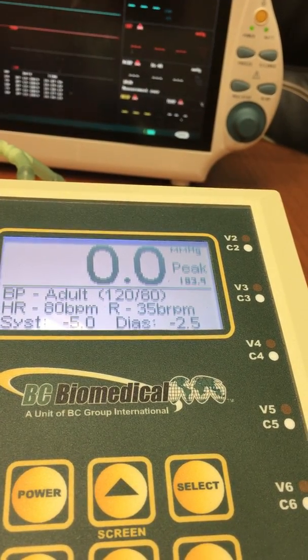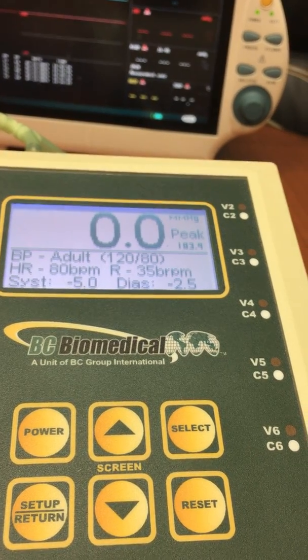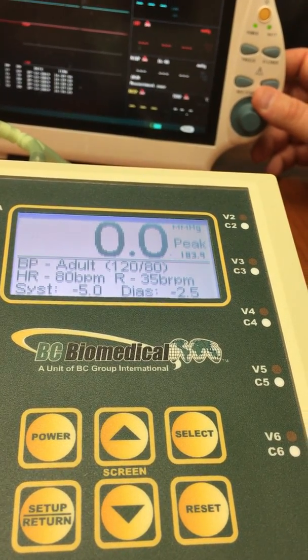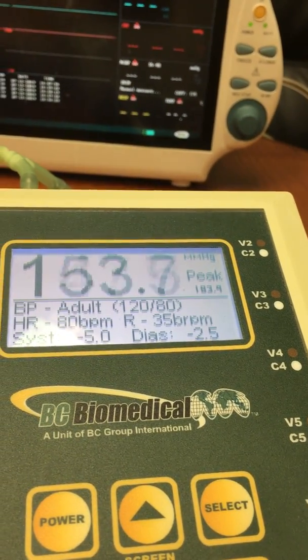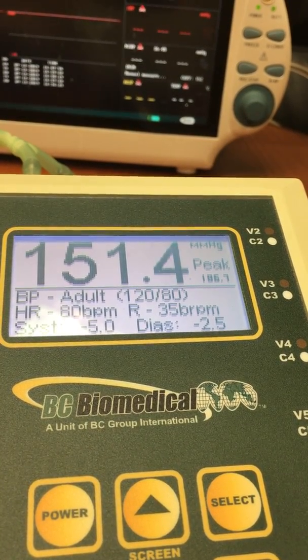For MindRays, we know that the offset needs to be minus 5 and minus 2.5 for the systolic and the diastolic. But the same is true for Philips or other monitors. There's a set of offsets that are used because every monitor manufacturer has their own algorithm and their own method for measuring the non-invasive blood pressure.